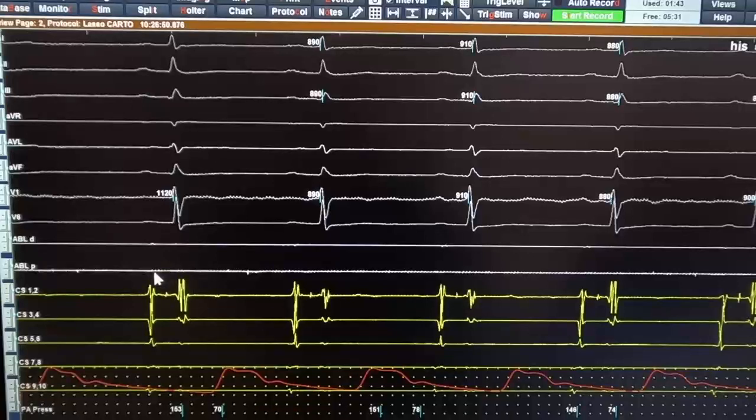What you can see here is almost the same proportion of atrial and ventricular activity at the tricuspid annulus catheter placement. You can see a small His bundle potential here. When you pull back the catheter, you can observe an increase of amplitude of atrial activity, and ventricular activity becomes a far field potential.